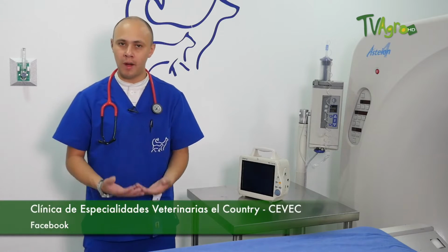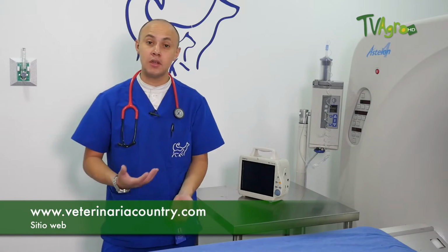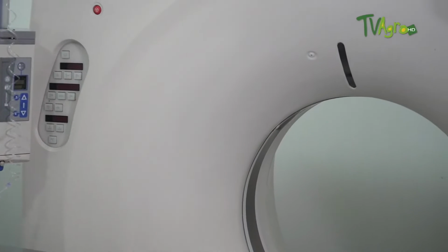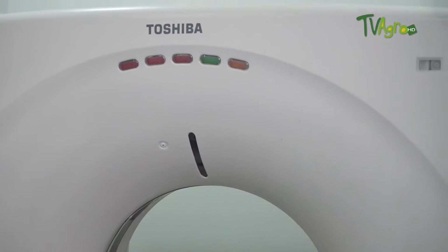Well, here we have a tomograph. The tomograph is human, but it is clearly adapted for veterinarians. Our clinic is adapting everything in a way that is as medically appropriate as possible. The idea is that with a team like this we can generate a diagnosis as strict as possible in patients, and that we give this type of machine the greatest use.